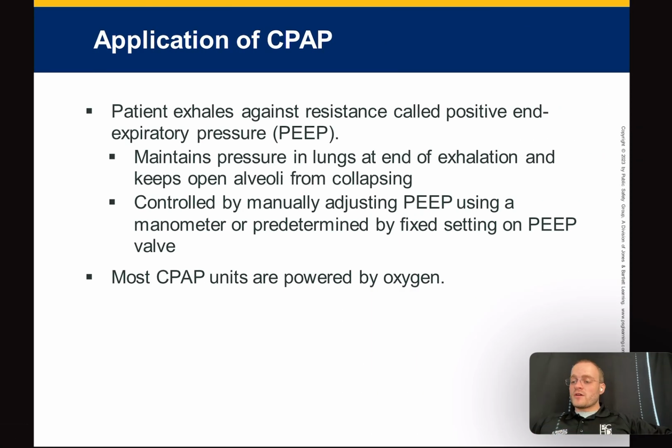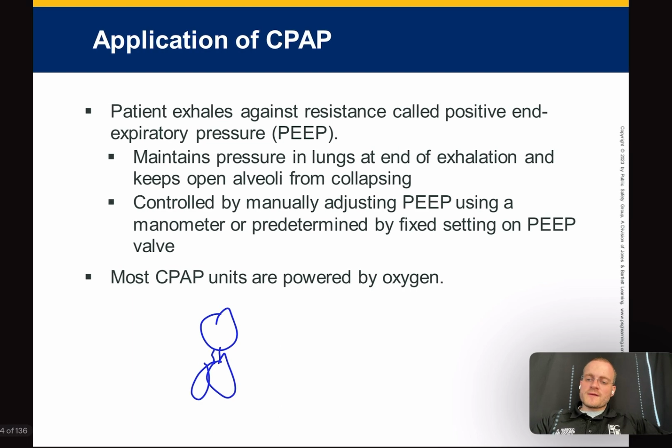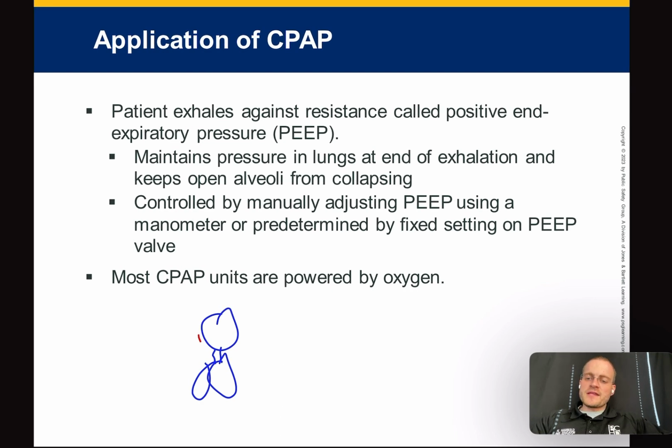Now, basically the phenomenon of this, let me just draw this out, good, right? So this is the patient, right? And this is their trachea. These are their lungs. So when they're breathing, what's happening is this is forcing air in at a constant rate, right? And it's actually measured in centimeters of water. So let's just say it's 10 centimeters of water, okay?